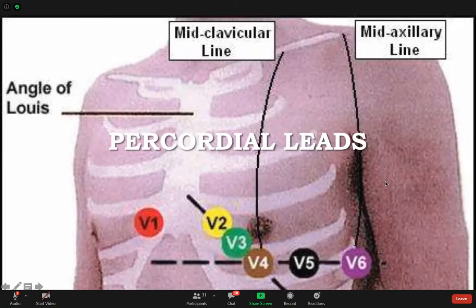So Yusuf asked about 7 and 8. وش معنى what we say is 7 and 8 لما نقول 15 lead ECG ولا right sided ECG؟ What happens? أحد يعرف؟ So it's a good question. طيب يبغى لنا نرجع للبوردر حقنا. And I'll come back to your question, Yusuf. So I'm going to explain it a little bit. Okay.